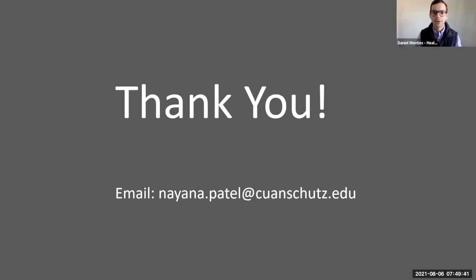Thank you. The next question has to do with the discrepancies seen between the Gleason score and the MRI imaging. This attendee is asking if maybe there's no correlation between the two, or maybe there's another reason. Sorry, maybe I'm not exactly getting the question, but it seems like there is a discrepancy between the Gleason score and the PI-RADS score. Am I correct? I believe so.